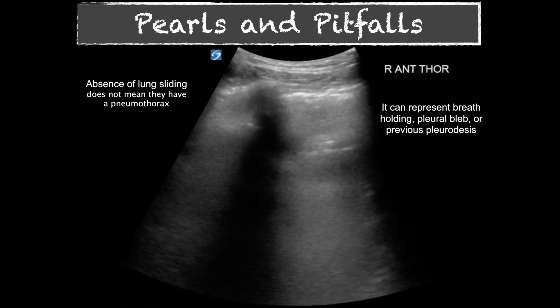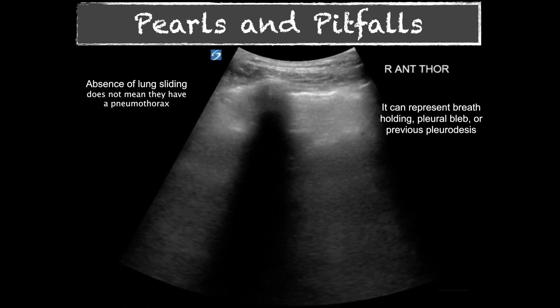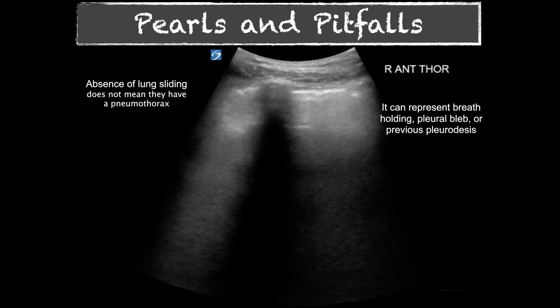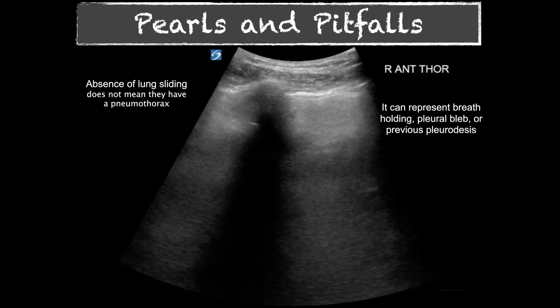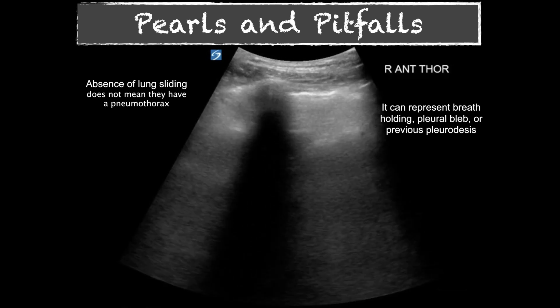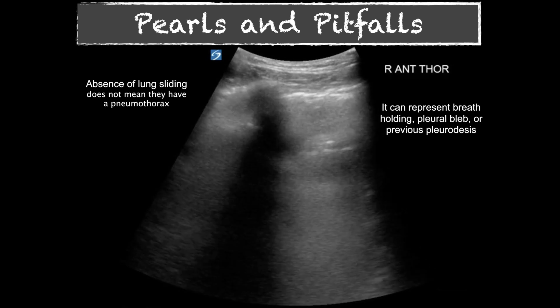Regarding lung sliding: the pleural line is identified here, and if we watch it, we don't see it moving or shimmying — no 'ants on the log' appearance. Absence of lung sliding does not mean pneumothorax. Presence of lung sliding rules out pneumothorax at that spot, but absence does not rule it in. Absence can be due to breath holding, a pleurobleb, or a previous pleurodesis. Finding a lung point is pathognomonic for pneumothorax, but absence of lung sliding alone is not.